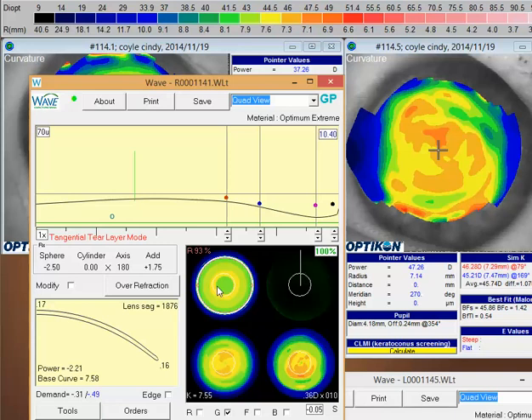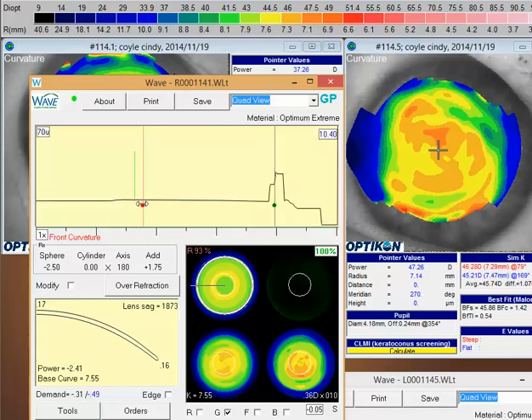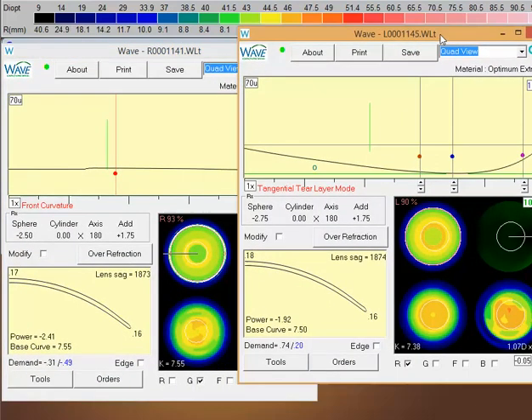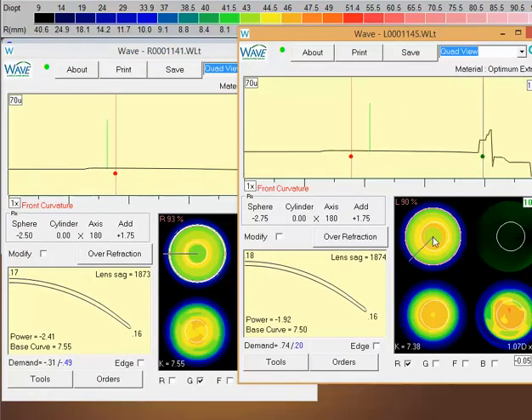So that moves us over to the last question about the lens positioning of that bifocal. I would have chosen the positions that you chose for both the right and left lens. I think those are good places to start off with, the left eye being the non-dominant eye and the right eye being the dominant eye. I would have done just like you did, slightly bigger than pupil on the right eye and slightly smaller on the left. Keep in mind these fit pretty much like a ProClear multifocal with a D design, you don't get a whole lot of reading out of these lenses.